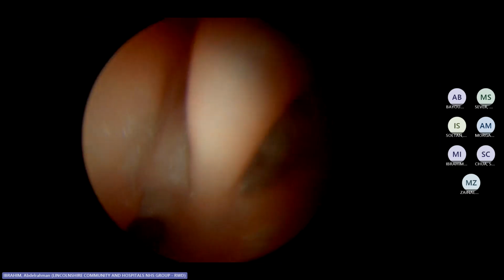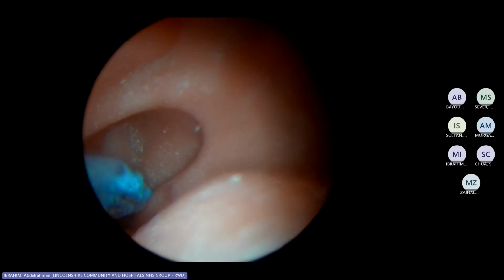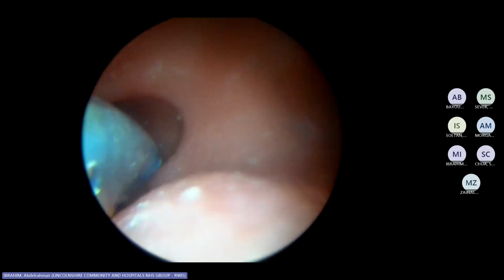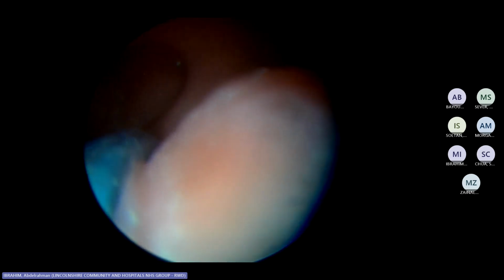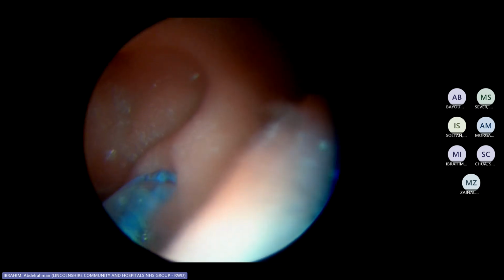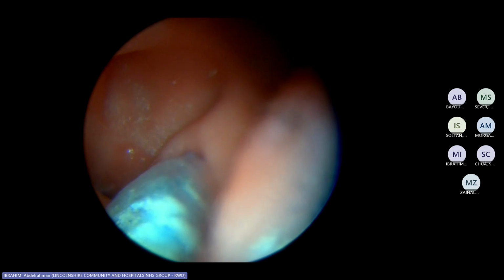So again, same principle. You go in, feel the edge. That's it. The model is not that easy, it's not that slippy. Again, feel the edge and then push, advance in. That's why I'm telling you the other one is better. It's already deflated, that's why. Okay, and then push out.